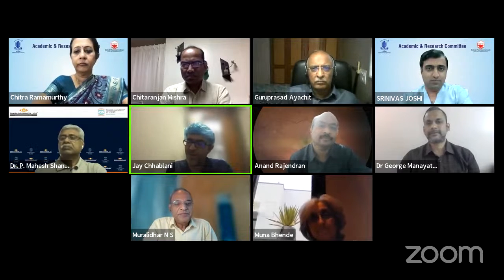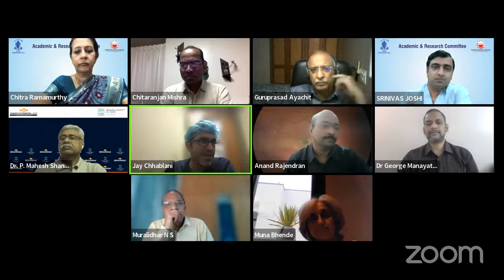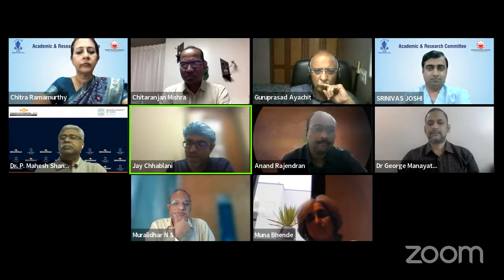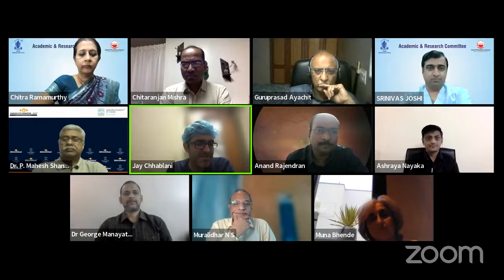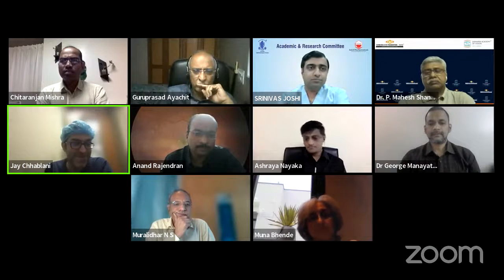No, so that was one of the interesting cases, I would say, that really taught me a lot, that OCT angio can still show you the network which may not be active. That was the network which we were seeing almost for 5 years. And then she came in the clinic with sudden vision loss, with a subretinal hemorrhage, which itself is very uncommon if you really think about type 1.